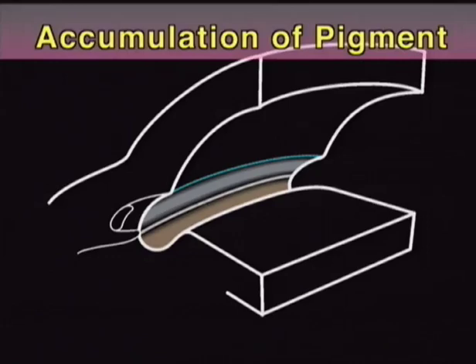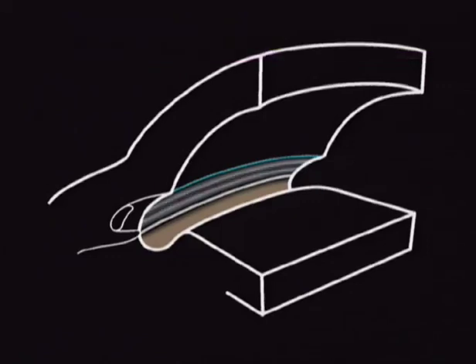Accumulation of pigment. Pigment accumulation in the anterior chamber may be found within the trabecular meshwork as endotrabecular pigment, at the surface of the trabeculum as epitrabecular pigment, and scattered all over as deposits at the bottom of the angle. Endotrabecular pigment appears hazy because it is veiled by the overlying meshwork, and thus it can be recognized only when occurring in large patches. Superficial pigment, in contrast, has saturated colours and sharp boundaries, and even small granules are seen distinctly.